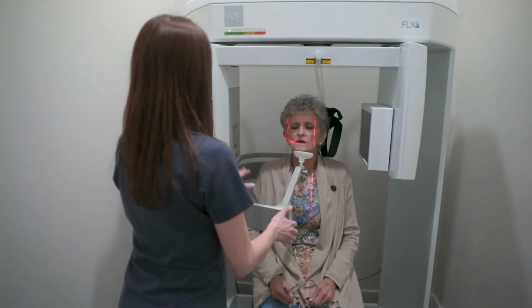The whole process is data-driven. There's three main data sets. We have facial scanning, we have intraoral scanning, which is scanning of the teeth and gingiva, and we have cone beam computed tomography, or CBCT. All those data sets are different, and they have different file types and whatnot, and they all get fused together to give us a virtual patient.